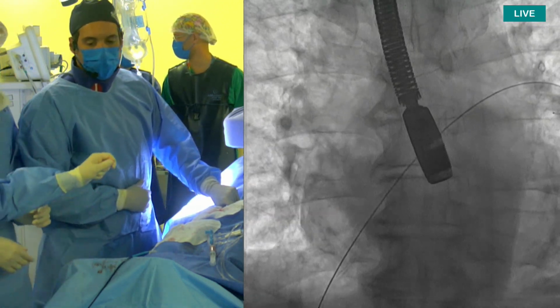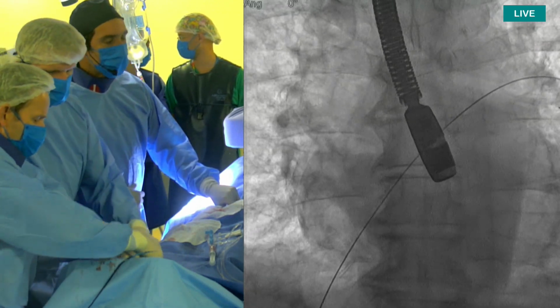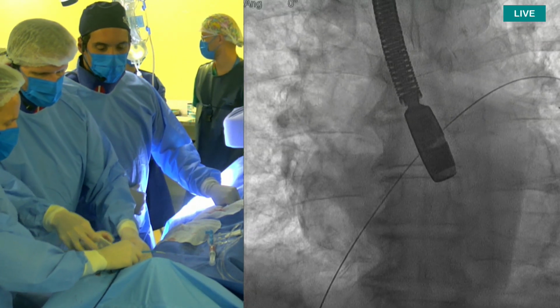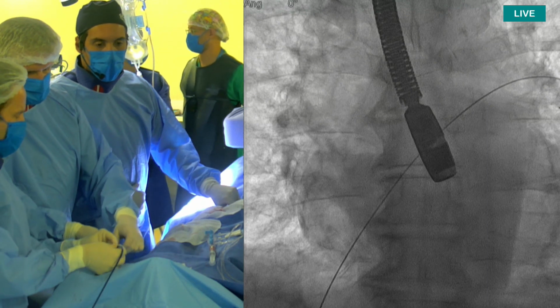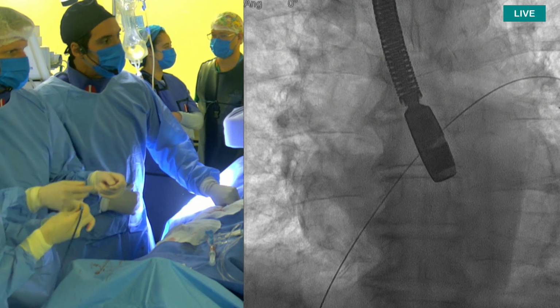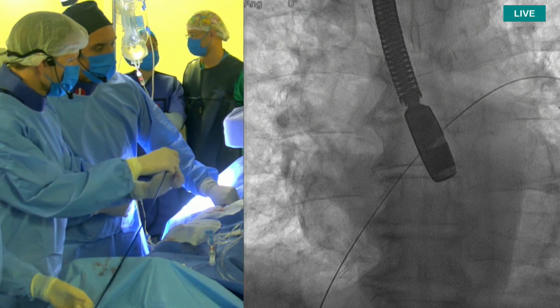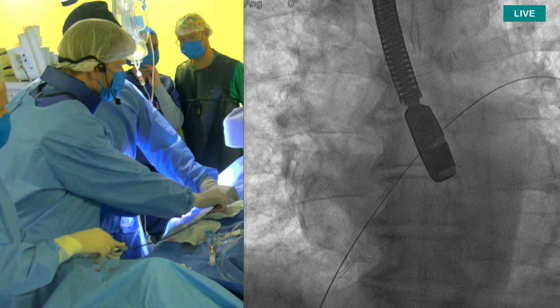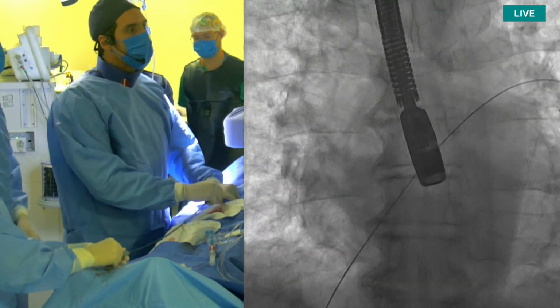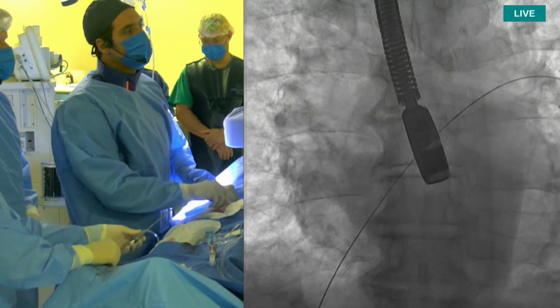Anibal, Marden, Enio, I understand we have a very experienced panel. We're having a bit of a discussion at the beginning of the procedure here. I would like to hear from the panel, what is your routine when you do the transseptal puncture? Do you usually give the full dose of heparin before the TSP, or do you give a half dose before the transseptal and then complete the dose? What is your routine?